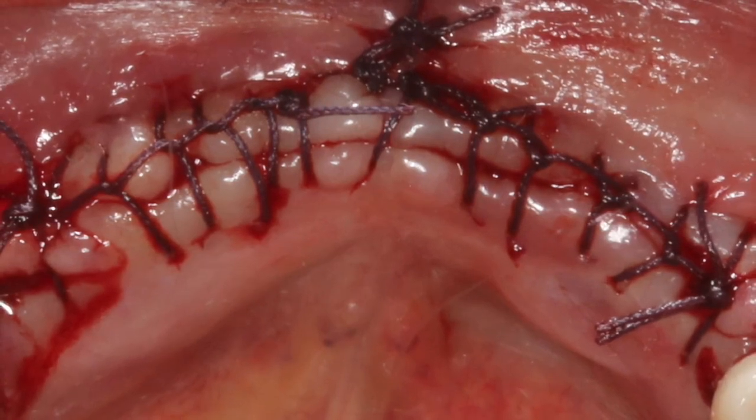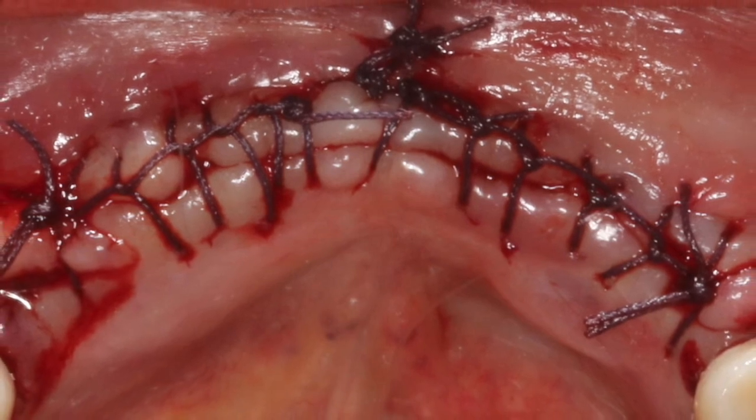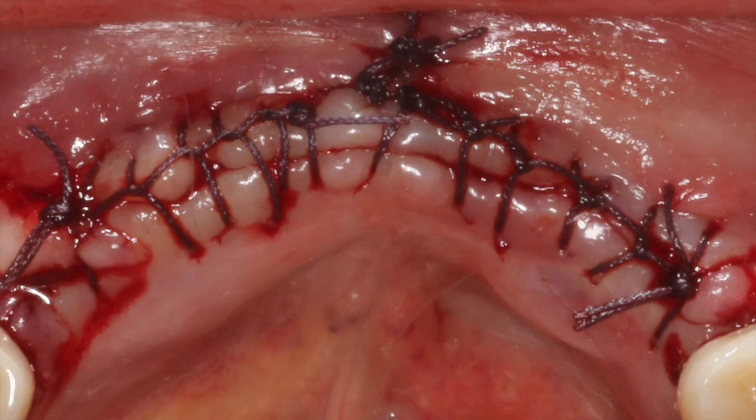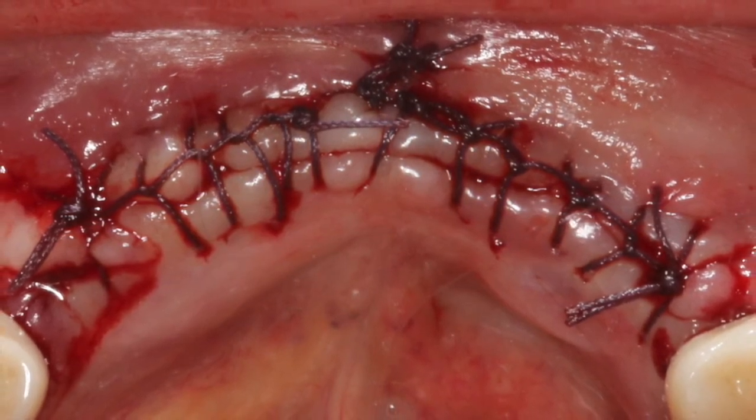I feel very, very comfortable with this bone grafting procedure. This is important to maintain the quality and quantity of bone in that site, especially when dental implants are to be considered.